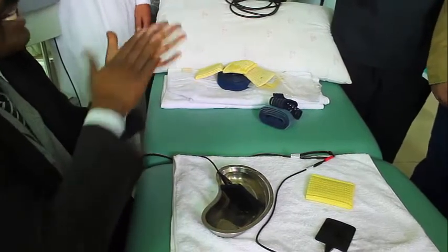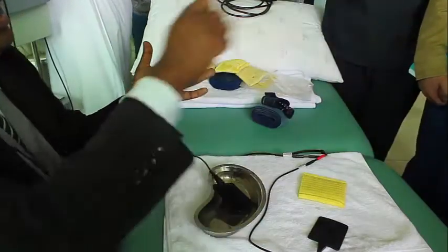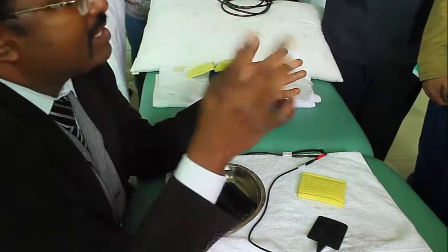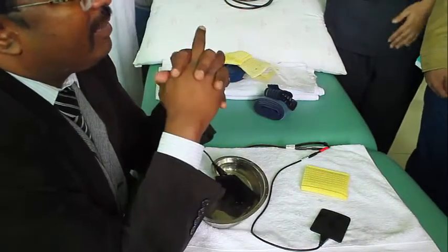You have to scrub the skin, so that excessive materials will go. Then you can apply the electrode. This is very rare. Scrubbing is very rarely done for patients, unless it is very, very limiting our treatment capacity.